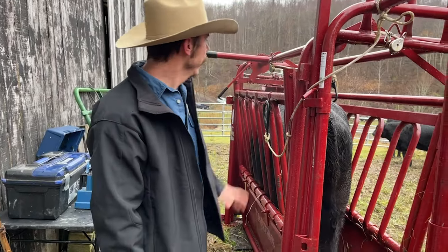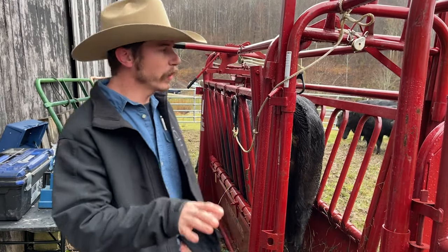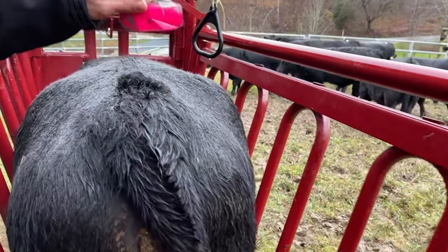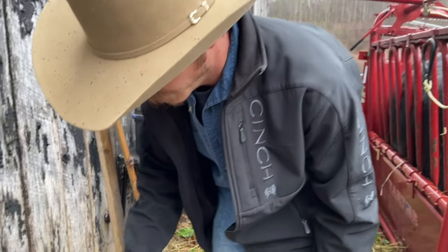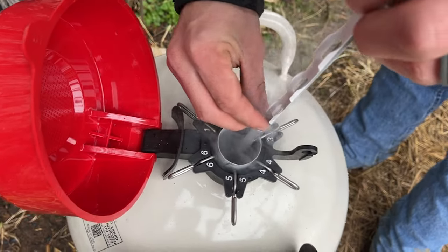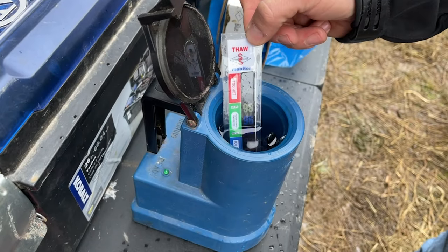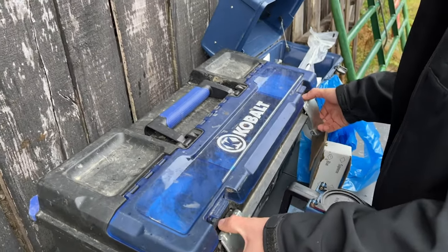We're back here with our cows that we set up for AI. It is Wednesday evening, and like I said on our protocol most of the time they're around 66 hours, but we've got one that's come in early. As you can see, her patch is good and pink, good and rubbed — she has been in standing heat, so we're going to go ahead and breed her. We'll get a straw of semen out. I'm going to drop the canister back down and put it straight into this water. This water is right at about 96 to 98 degrees. We're going to let that sit for at least a minute.